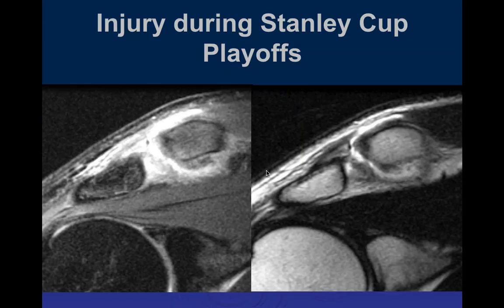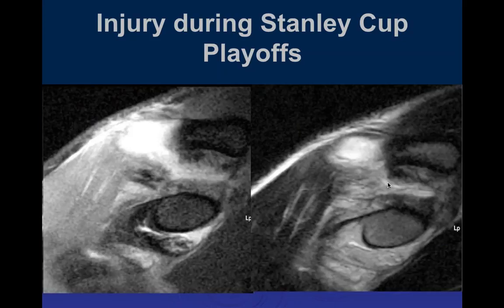Type 3 is ugly, and Types 4 and 5 are uglier. In this patient injured during Stanley Cup playoffs, a coronal fat-sat and T2 image shows mild separation of the AC joint with significant edema. The fluid extends above the superior aspect of the capsule, confirming AC separation. We'd like to evaluate the CC ligament as well.